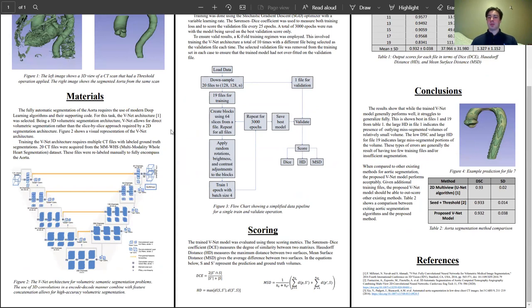In this case we're employing the deep learning architecture VNet. VNet is a fully convolutional encoder decoder network with skip pathways on each major level.